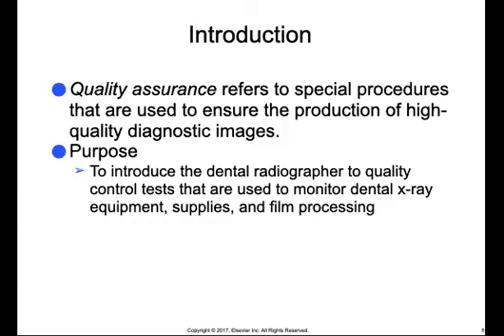So quality assurance refers to special procedures that are used to ensure the production of high quality diagnostic images. And the purpose of all of this is to introduce the radiographer, you, to quality control tests that are used to monitor dental x-ray equipment, supplies, and film processing. Although the dentist is responsible for ensuring that these things are done, the tasks themselves are typically left for the dental radiographers.